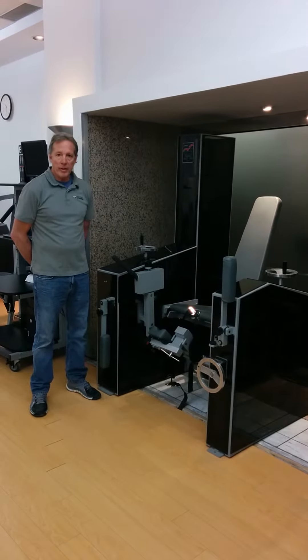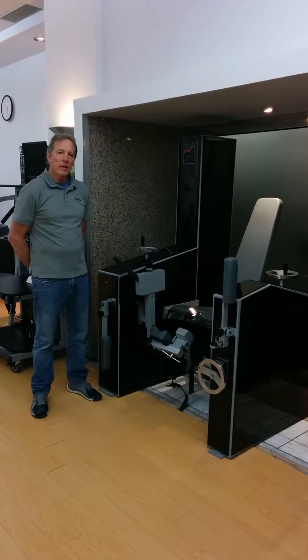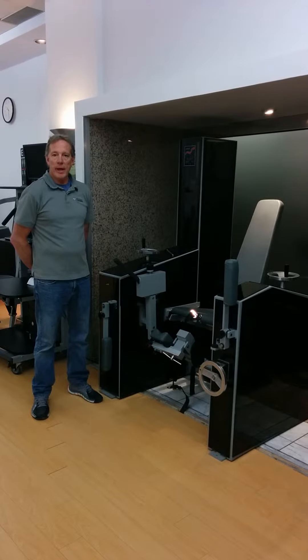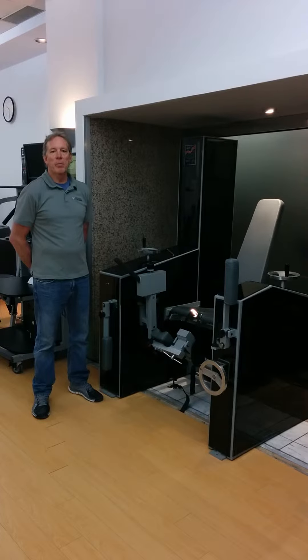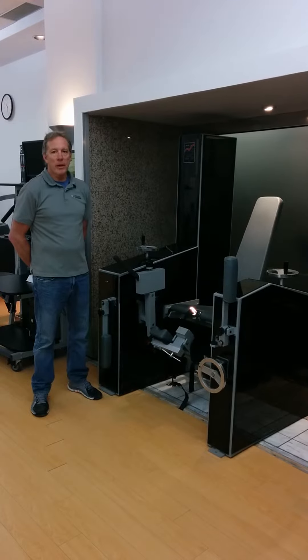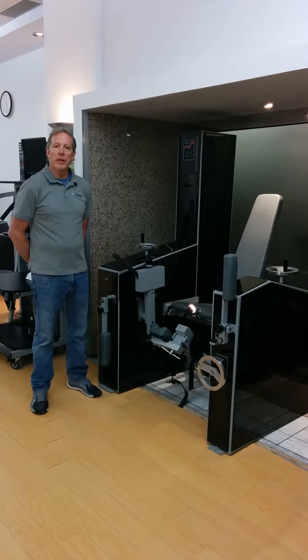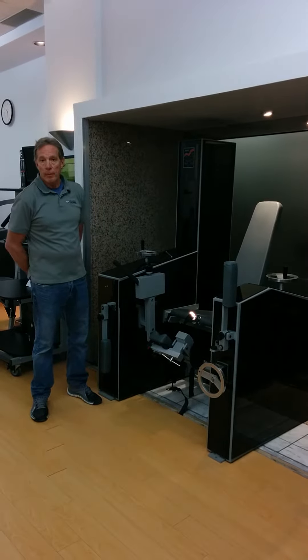This machine is able to isolate the movement of the knee, both in flexion and extension, to be able to test and determine if there are limitations in your range, limitations in your strength. And by doing that, we can prescribe a very specific exercise program for rehabilitation. Also, if you're athletic, this machine is great in order to develop a baseline of where your strength is to compare it to normal athletes of your own sport.